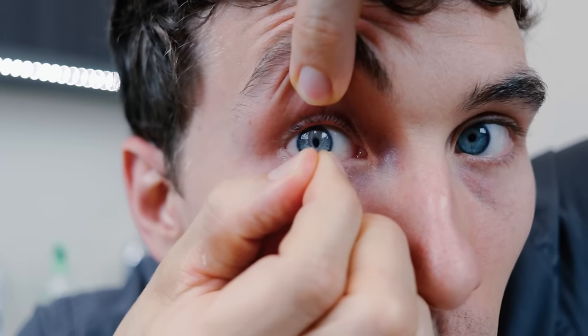In this video, I'm going to show you how to take out contact lenses. Plus, I'll even show you how to take out the contact lens that gets stuck in the eye.